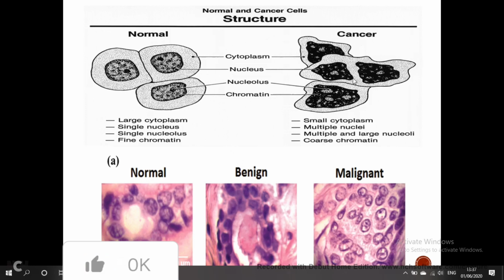But you can see when it becomes cancerous, there is a shape change, the borders change, the nuclear morphology changes, the cytoplasm changes, and this becomes malignant. In malignant tumors, the cells have different morphology. The outer membranes are irregular. The chromatin is clumped, and you can see some of the cells are bigger, some are smaller, some are ovoid. I mean, there's no uniformity in the malignant cells.